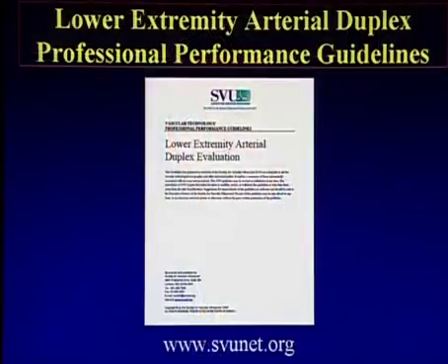I'll be giving a brief overview of the SVU Professional Performance Guidelines. Then Anne-Marie Kopinski will follow with a comprehensive explanation of the lower extremity arterial duplex evaluation. Anne-Marie will then return to demonstrate these techniques on our patient model.